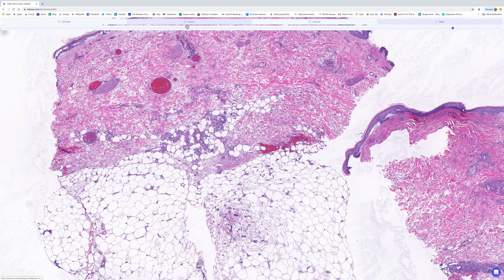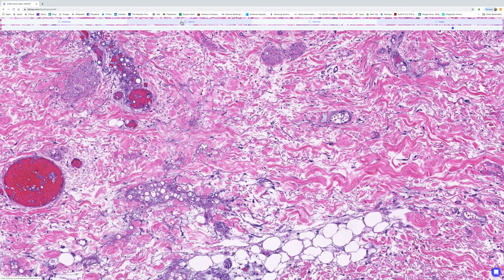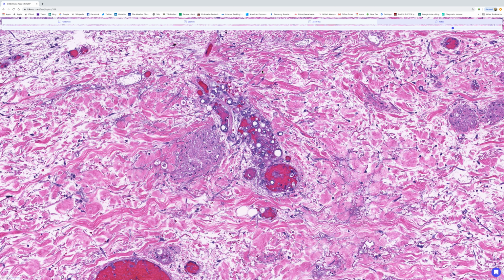I'll just bring it up to maximum, and then we'll be able to have a look. And that's our best. If we look here, we can see large numbers of hyphae, and occasional branches are seen. There's acute angle branching there, and acute angle branching here. Now, Fusarium species, they branch at anything from acute angle right through to 90 degrees. And this is one of the ways that they differ from Aspergillus.